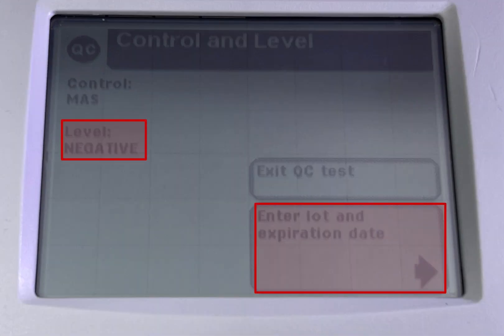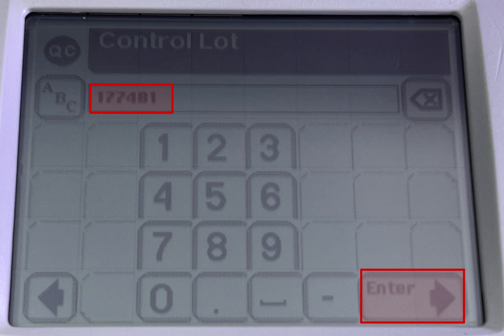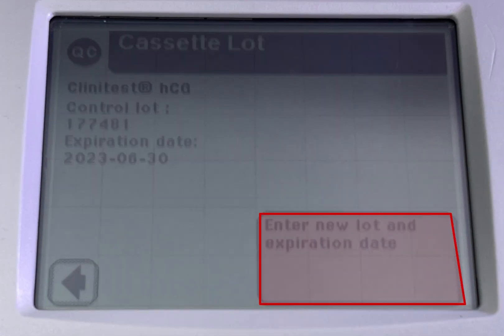Level negative. Click on enter lot and expiration date. Scan the negative QC control lot barcode on the card. Click enter, then add the expiration date and click enter.